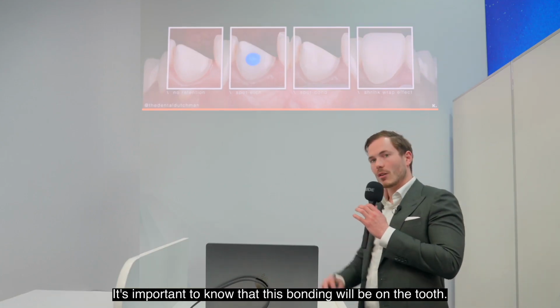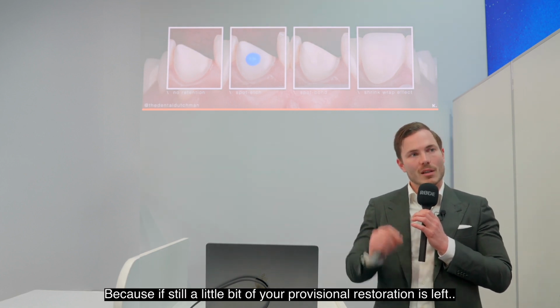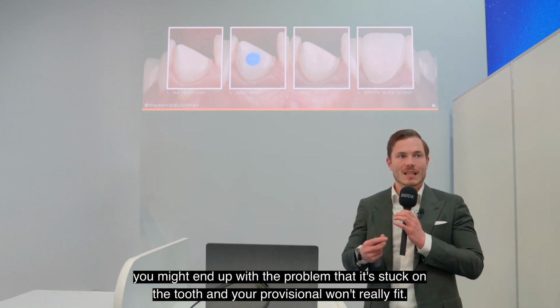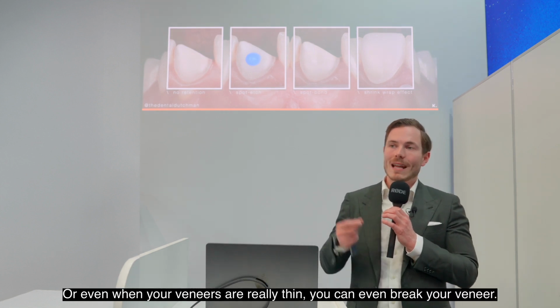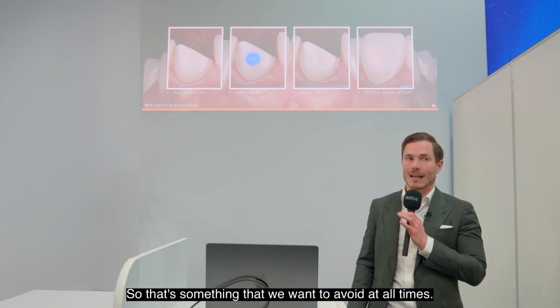It's important to know that this bonding will be on the tooth, so you need to remove it before you place your final restoration. Because if still a little bit of your provisional restoration is left, you might end up with the problem that it's stuck on a tooth and your provisional won't really fit. Or even when your veneers are really thin, you can even break your veneers. So that's something that we want to avoid at all times.